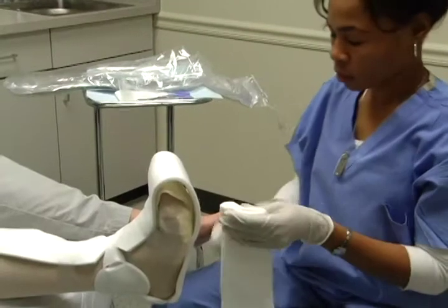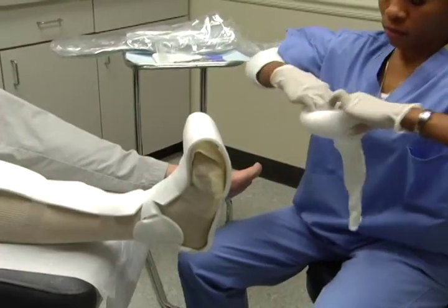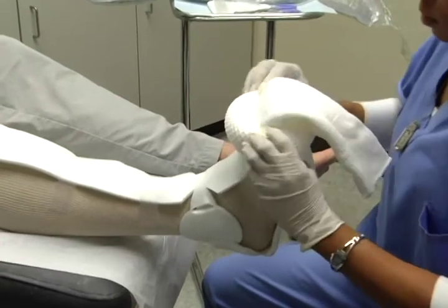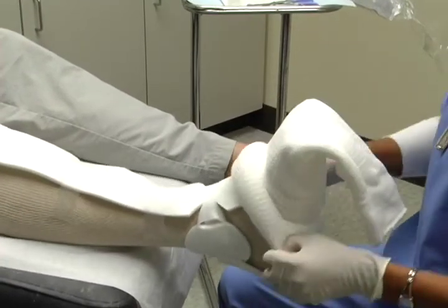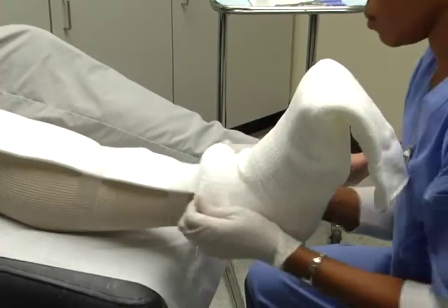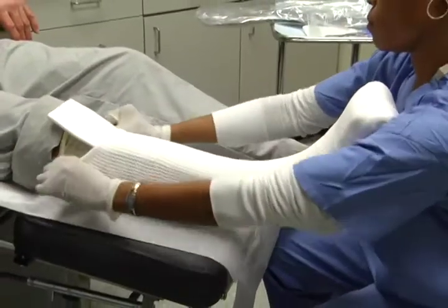Step 4. Thick white sleeve. Apply the thick white sleeve over the protective felt padding. Start by rolling it into the shape of a donut. Place the sleeve over the foot and use your thumbs to unroll the sleeve, stopping just short of the tan stockinette at the knee. Ensure all protective layers are not being disrupted and are not binding the toes.